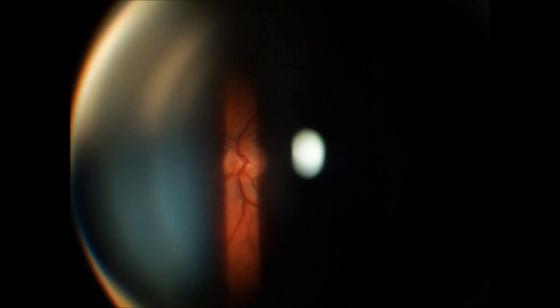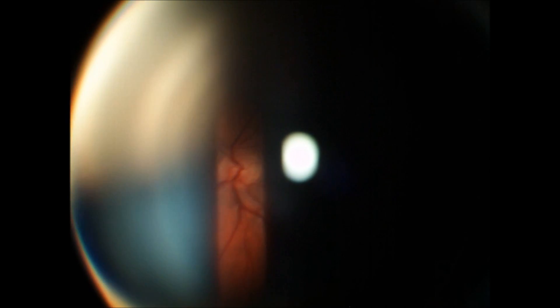Now we'll assess the disc at higher magnification. With the disc in higher magnification we can examine it in greater detail. The first thing we're going to look at is the disc margins — we want to make sure that the entirety of the margin is well defined with no blurring, and that's what we have here. You can also note the colour and the shape. We'll have a look at the cup to disc ratio — in Sean's case here that's sitting at about 0.25. We'll also look at the neuroretinal rim, and you want to make sure that it follows the ISNT rule. If it follows the ISNT rule you would record that as ISNT positive, and if it didn't follow it you would record that as ISNT negative.